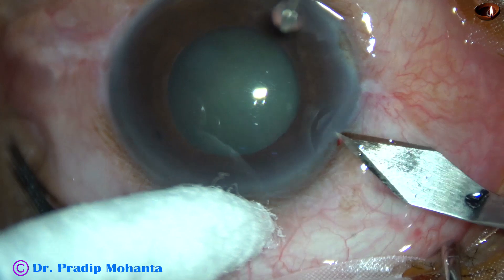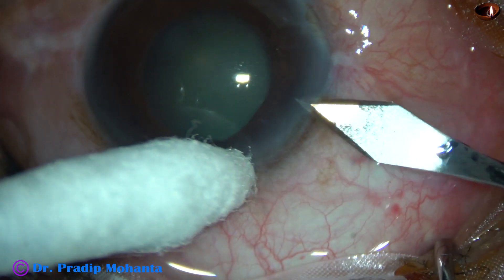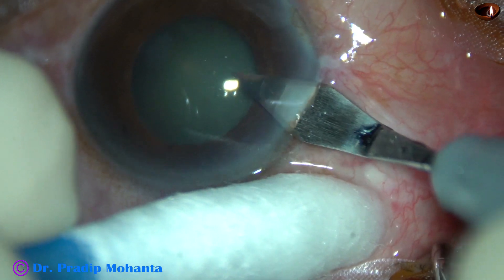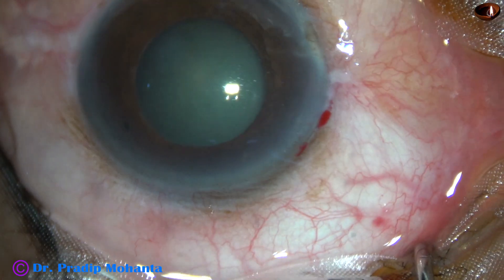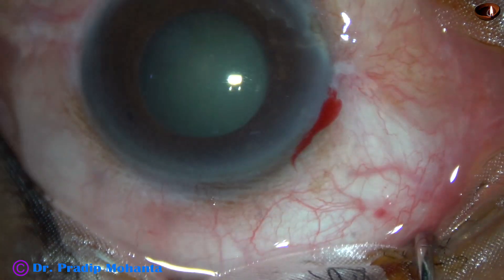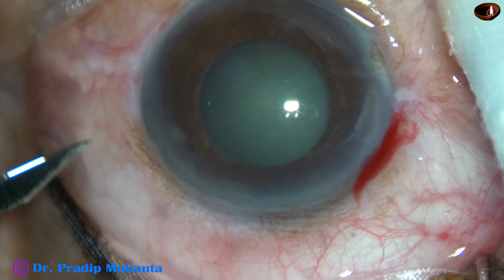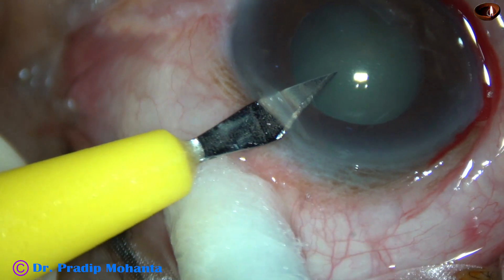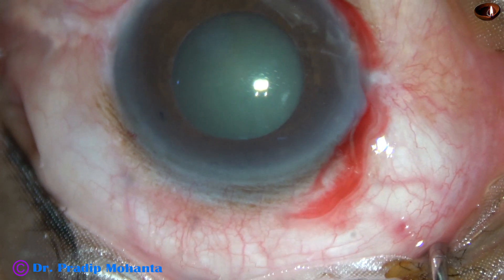This is the main incision with a 2.8 mm steel keratome at around 170 degrees. And now a side port is being made about 3.5 clock hours away on the left side.